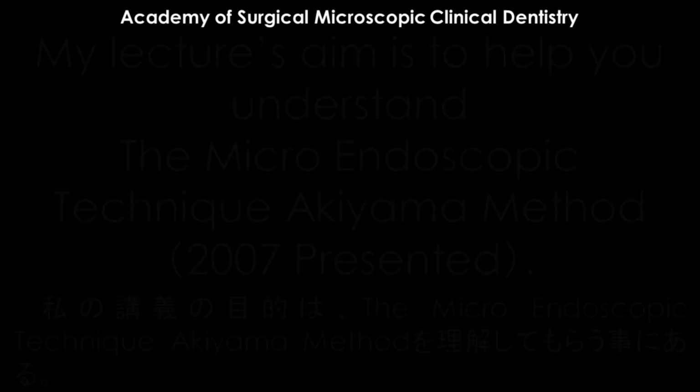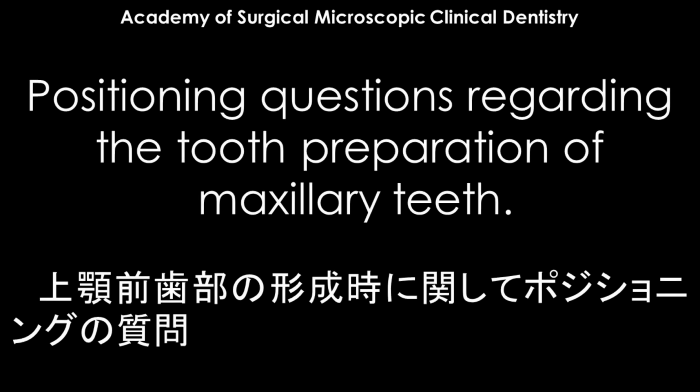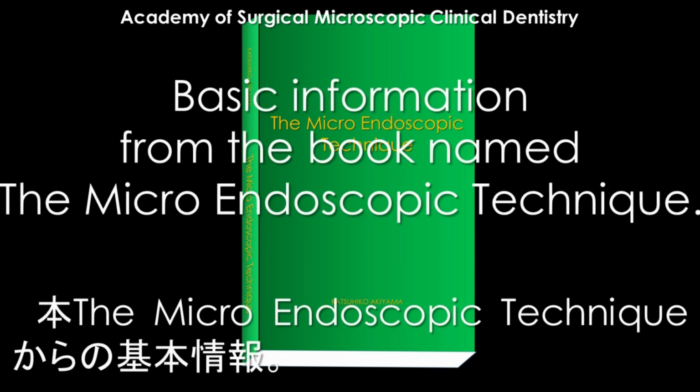This video answers the microendoscopic technique method question, positioning questions regarding the tooth preparation of maxillary teeth. I would like to know the positioning of the tooth preparation on the palate side of the maxillary anterior teeth. Basic information from the book named the microendoscopic technique AKIYAMA method.